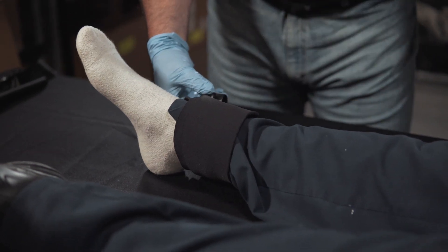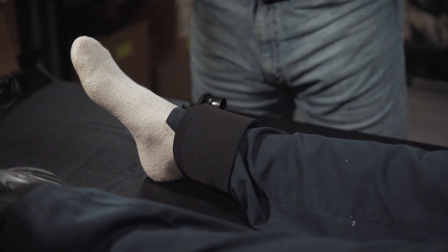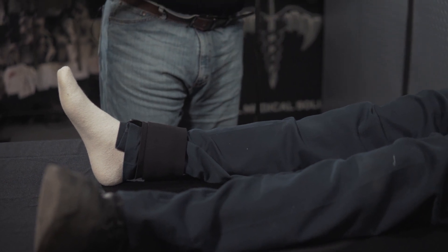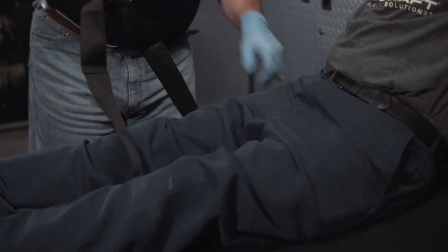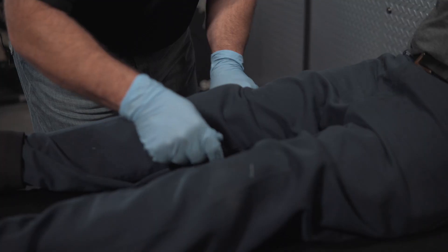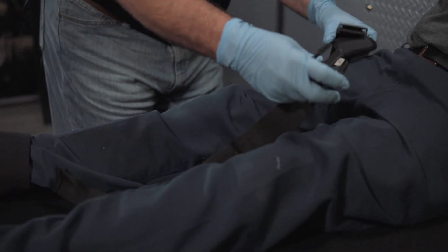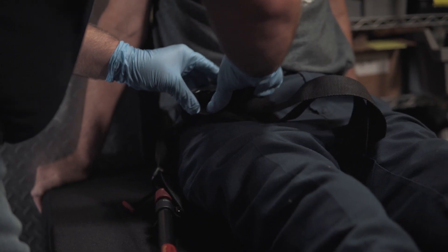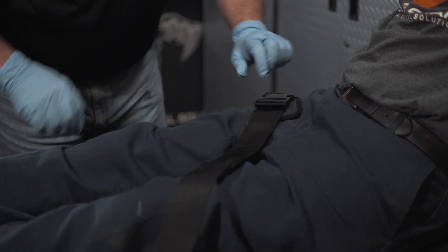You want to make sure that the end cap is facing towards the patient's head. The next thing we're going to do is grab the actual bulk of the device and apply the hip strap first. Start by feeding the male end of the strap under the leg, utilizing that natural gap created by the back of the knee. Scissor it up into place, female end on top of the pelvis, bring the male end around, clip it in, then take the slack out gently — remembering we've got a broken bone up here, so be careful there.